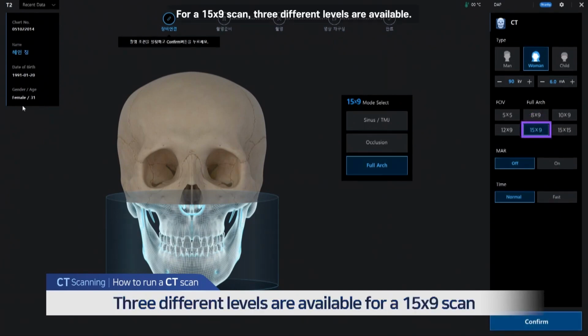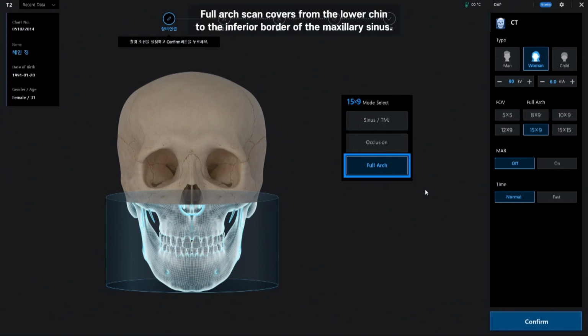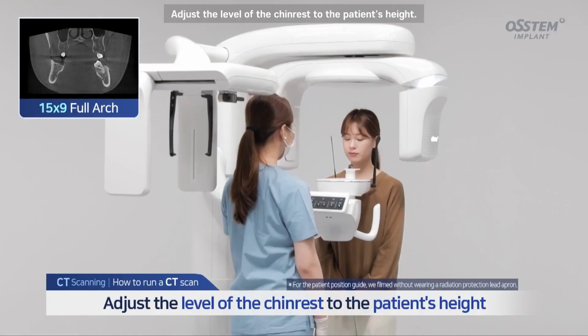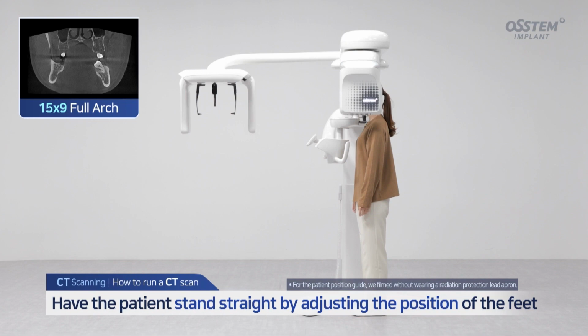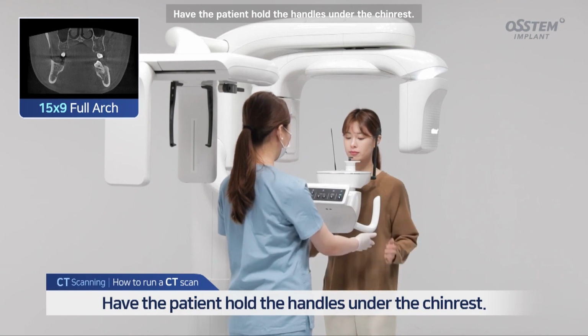For a 15x9 scan, 3 different levels are available. Full arch scan covers from the lower chin to the inferior border of the maxillary sinus. Adjust the level of the chin rest to the patient's height. Have the patient stand straight with their feet in a comfortable position. Have the patient hold the handles under the chin rest.